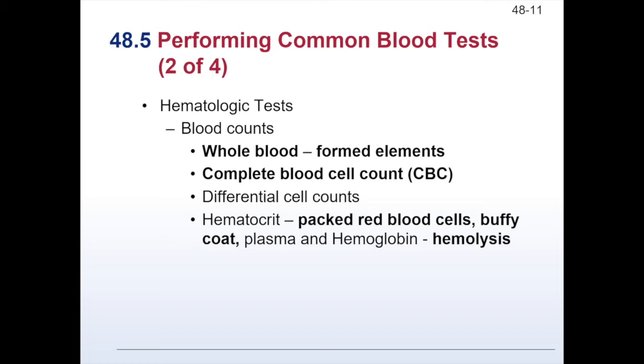The platelet count is estimated, and hematocrit or hemoglobin counts are determined. For the differential cell counts, a stain is applied to distinguish the 5 different types. These include neutrophils, basophils, eosinophils, lymphocytes, and monocytes. The hematocrit is measured after spinning a sample of whole blood in the centrifuge to separate the packed red blood cells from the outer parts. The buffy coat contains the white blood cells and the platelets. Automated hematocrit readers may also be available.